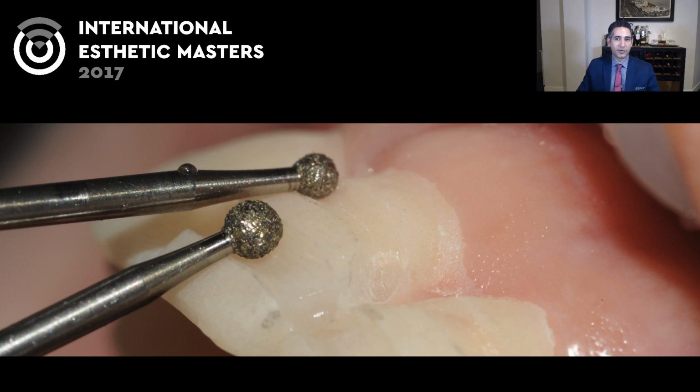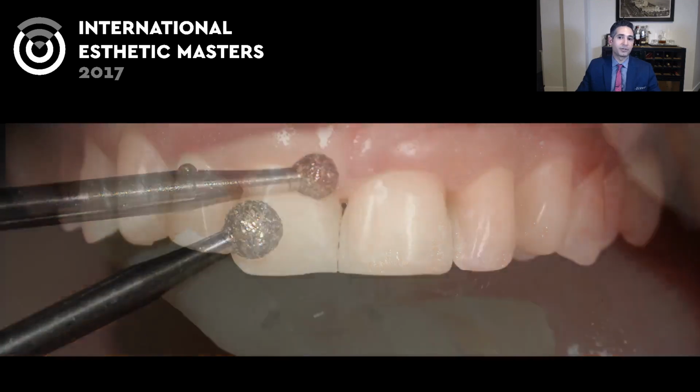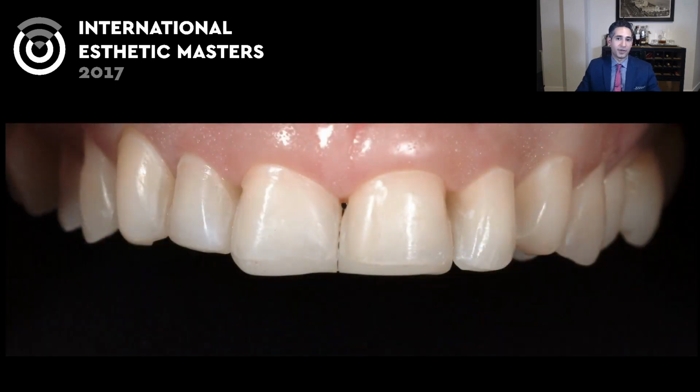So if the provisional was already thick enough that we didn't actually touch tooth structure here, that means we didn't need any preparation there. So it's a great way to make sure you have exactly the reduction you need, and the result is a super conservative, very conservative preparation, which is the best in my opinion to prevent problems. A lot of patients these days want to have this, and really there's nothing better than preserving this tooth structure, and I think that's the best way to get this long-term success.